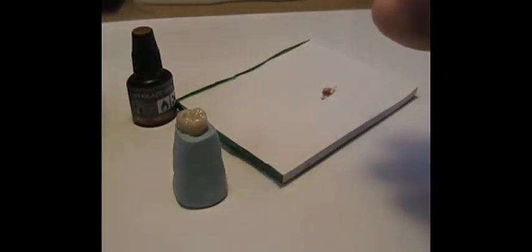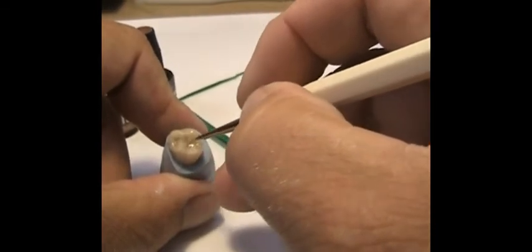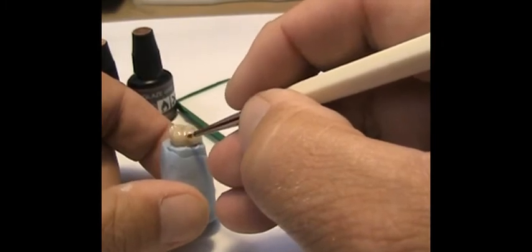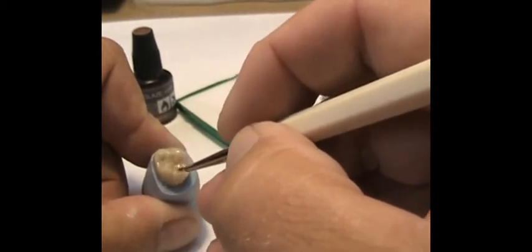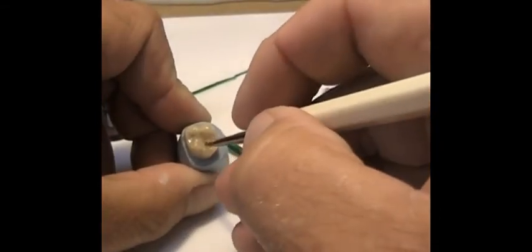All I'm doing is highlighting those areas to give a polychromatic effect. There are some grooves we can do on the facial as well if we want. Subtlety — not being garish — is the way to go with any of this. We just want something that gives it a polychromatic look, not one that really jumps out at you, because if the other teeth don't jump out with that kind of anatomy, it's kind of foolish.